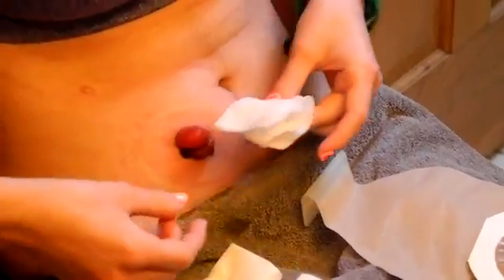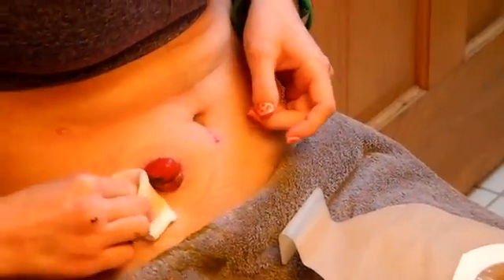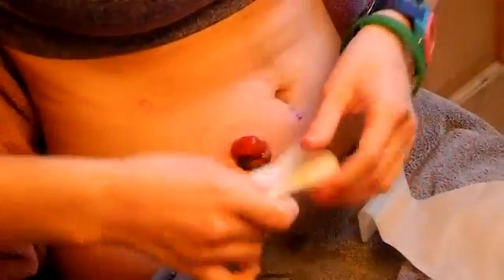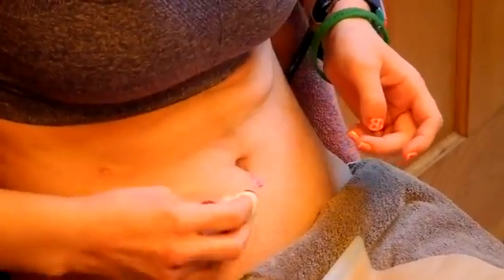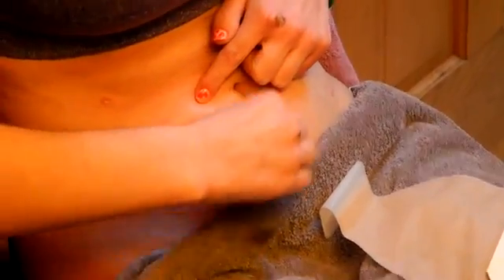Okay, so what we're going to do is we're going to clean off my skin because it leaked a little bit. So I'm just going to clean this off again with some saline solution. Thank you, and luckily I have a helper since I am still a little bit new at this.